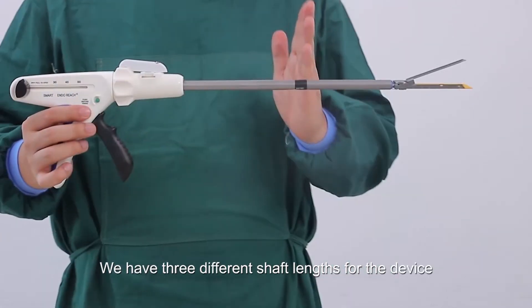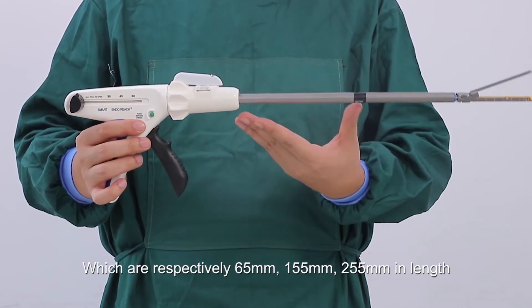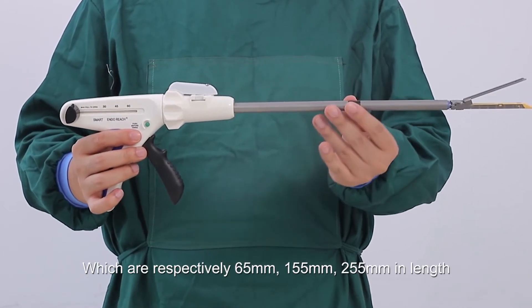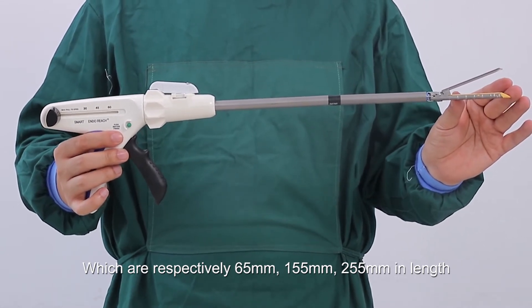We have three different shaft lengths for the device: short, normal, and long, which are respectively 65 millimeters, 155 millimeters, and 255 millimeters in length.